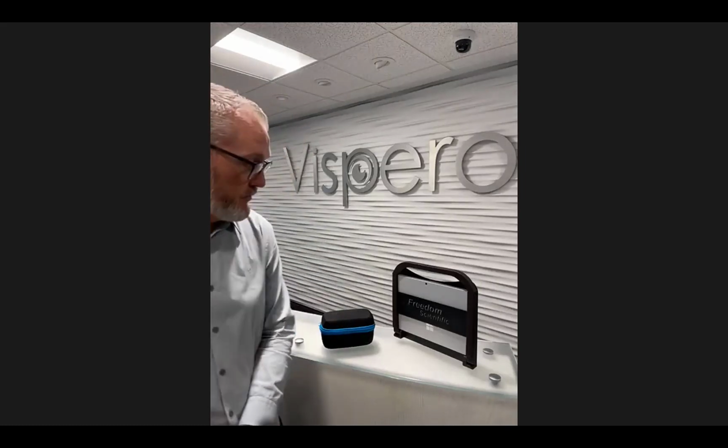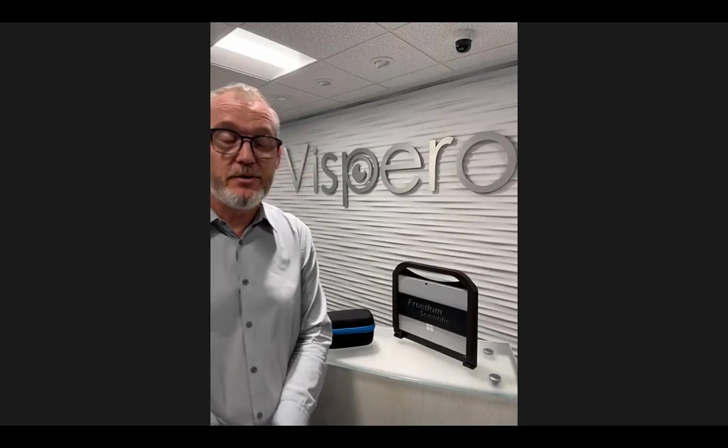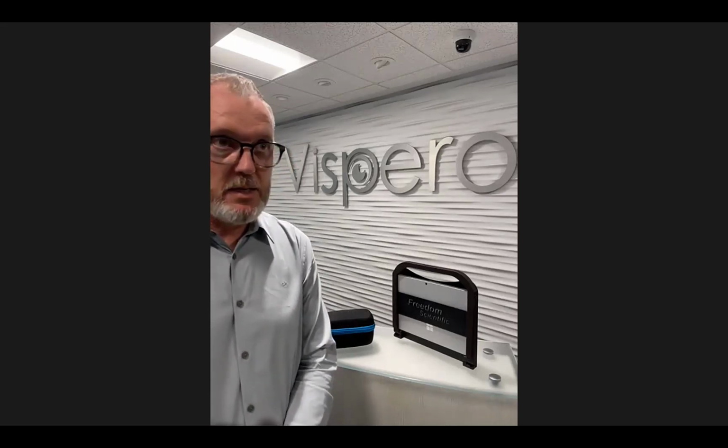Someone said, if you've not used a Surface Pro, they are extremely light and will not add much weight to this at all, which is so true. It is one of the reasons why we've chosen this unit. It's fairly powerful with Windows machines going, and the big benefit with this thing, obviously, is it can integrate with Zoom text, which for the classroom is key. It's phenomenal, yeah. Someone said there are many models of the Surface Pro. Is there a recommended model or a baseline of recommended GPU or amount of RAM?